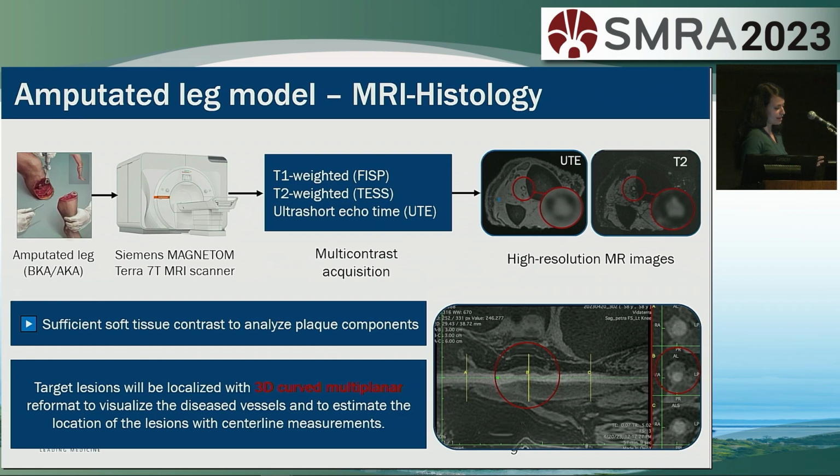We evaluate the lower extremity plaques using these multi-contrast acquisitions. And we also evaluate penetrability and lesion metrics such as lesion length and vessel diameters.